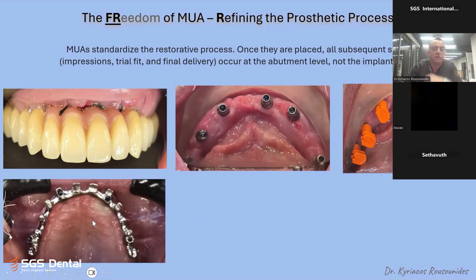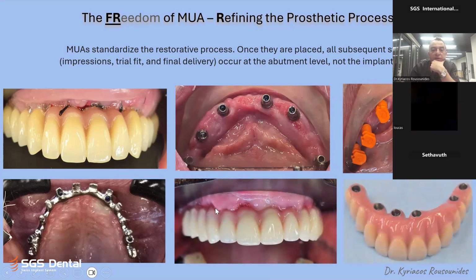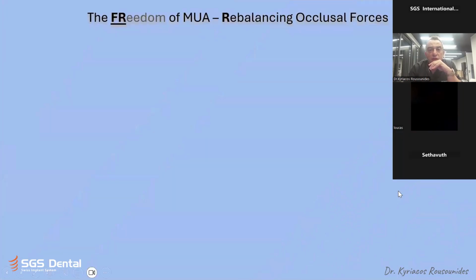The lower pictures are for a full arch, where we see that the results come out aesthetically approved, and the screws are in areas where we can better control them, and they are also not visible. We'll see in a while.